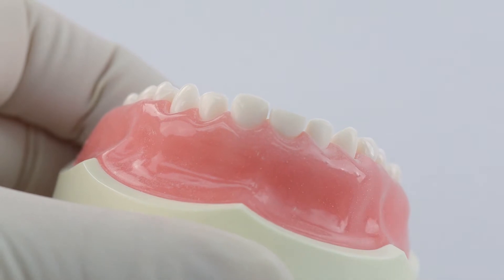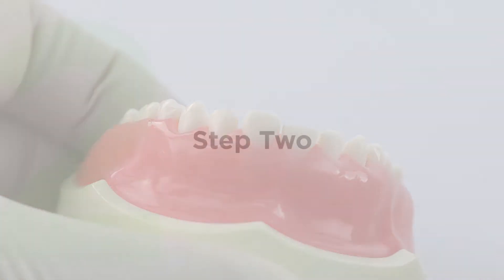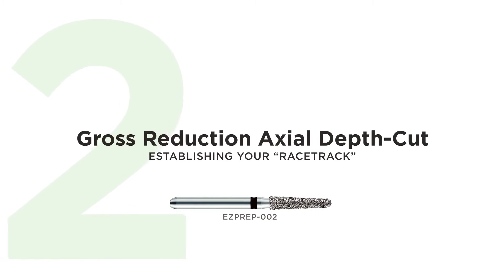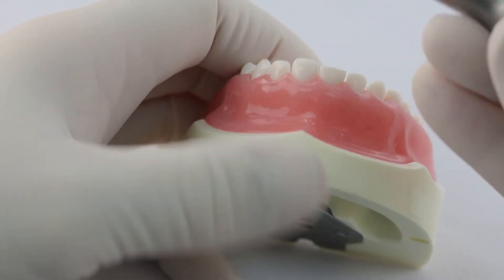And that's your incisal reduction. You can see the incisal reduction there is about a millimeter and a half. So we're going to use our number two burr here, which is 0.8 millimeters at the tip.